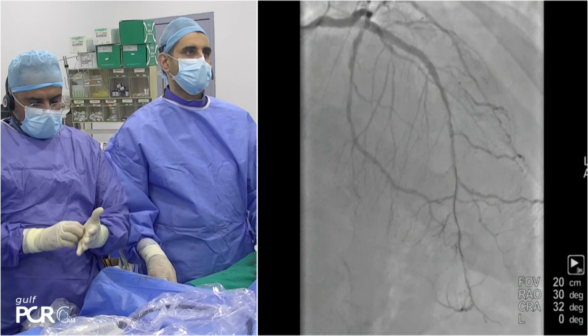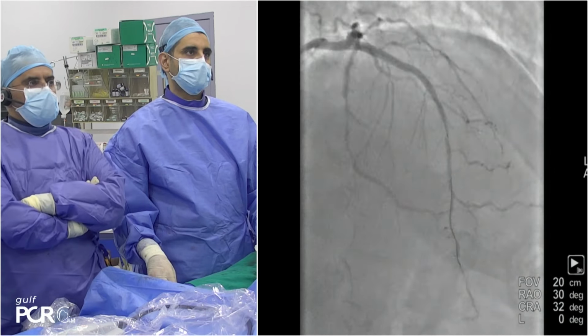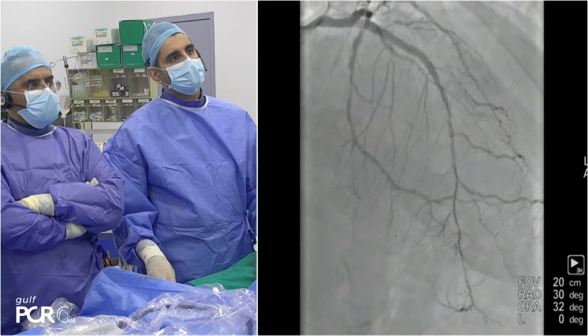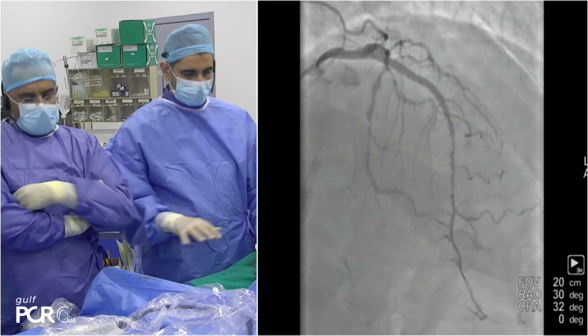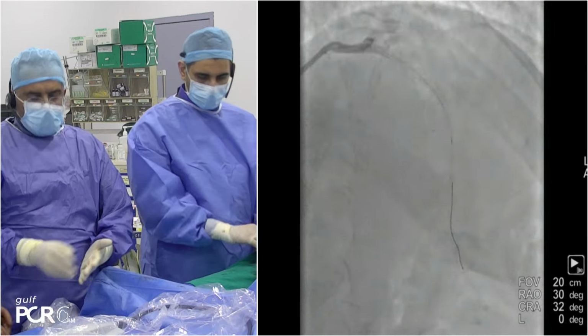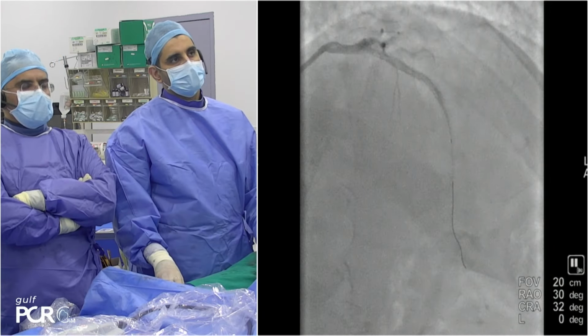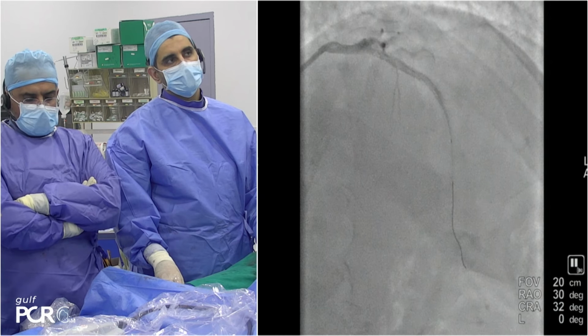So if the outflow of the stent, if you are convinced that you achieved at least 80%, I think it's safe to leave it like this. I don't suggest that you put an additional stent, but probably you work within the stent. The outflow should be at least 80%, because we know this is the predictor of stent thrombosis.